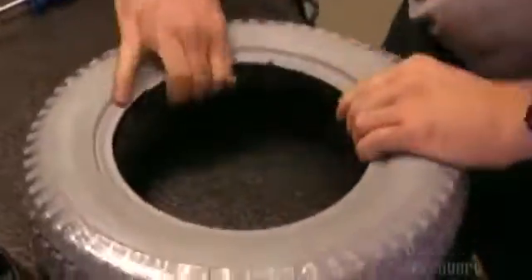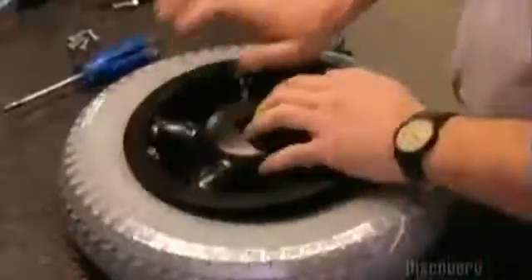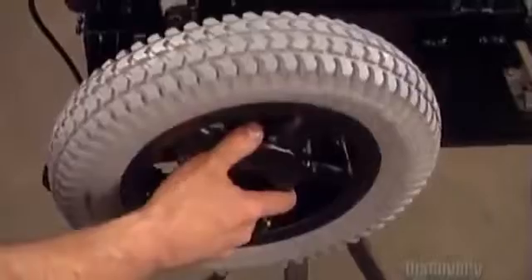Workers squeeze the inner tube into the rear wheel rim. The air valve slips through and the front and back parts attach with screws. Now the rear wheel can go onto the motor.